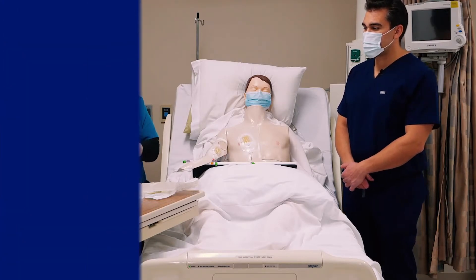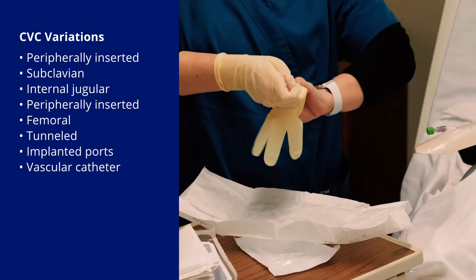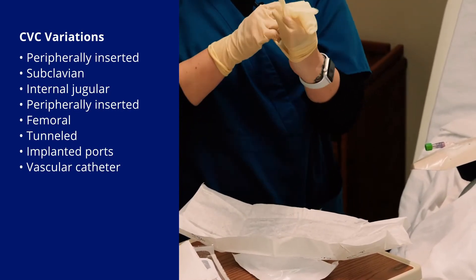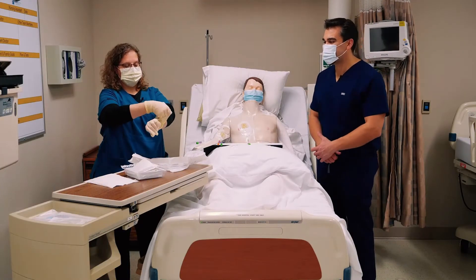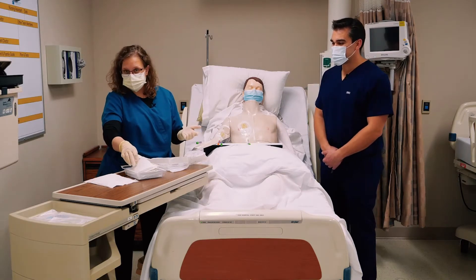It slides on pretty well. The only people who put on sterile gloves right the first time every time are people who literally do this all day long. So don't feel like you need to apologize to your patient or be in a rush — especially if you're a student and your hands are shaking a lot. Okay, now I'm going to go ahead and set up a sterile field.